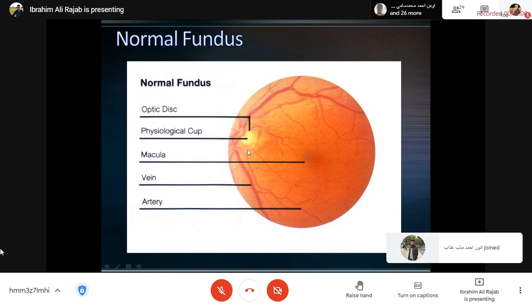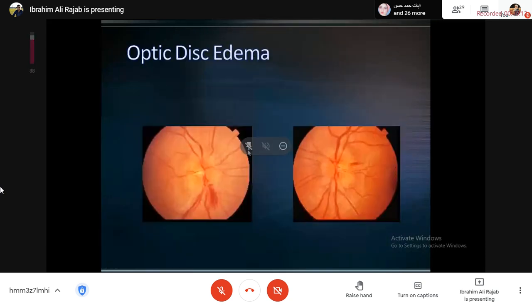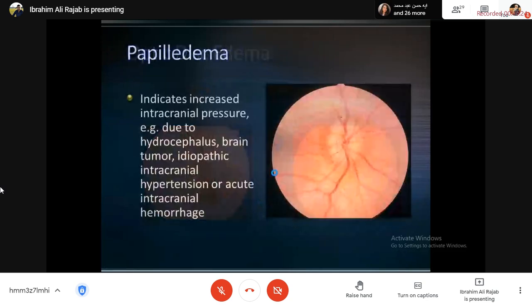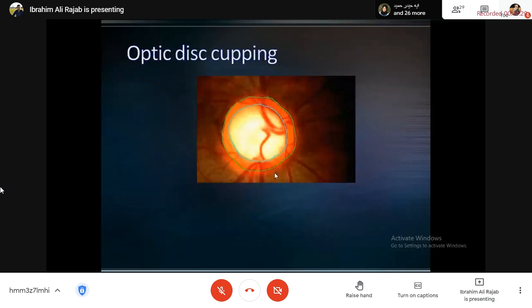السايز مال الأوبتيك ديسك إيش قد؟ خليها ببالك وشوفي هذا، وشوفي مثلا هاي الصورة، شوفي الأوبتيك ديسك هذا السنترالي السمول، وايتش اريا، وشوفي النيوروريتينال ريم شلون صايره، إيش قد الحجم مالتها. وشوفي هذا الأوبتيك ديسك كاب، قارني طول الأوبتيك ديسك كله من هنا لهنا، وقارني طول الكاب من هنا لهنا.